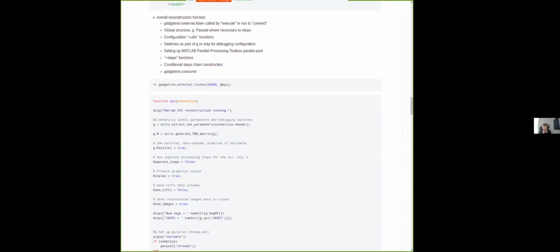So when you build everything bottom up, those images can't leverage what's already in the 16.04 image, and so they get really large. The newer Ubuntus we don't have to modify, so they can be smaller. But you still have images that are a couple of gigabytes.